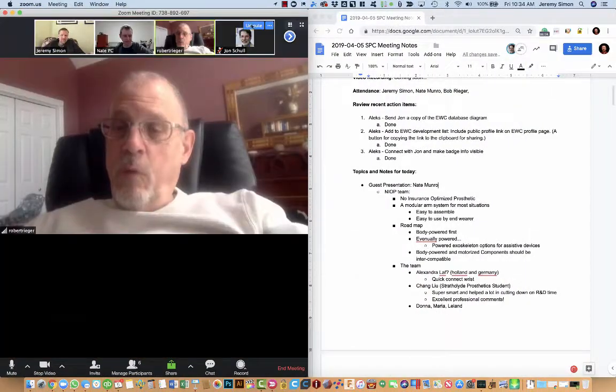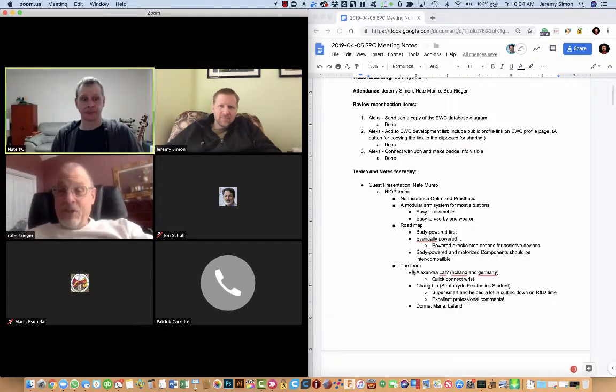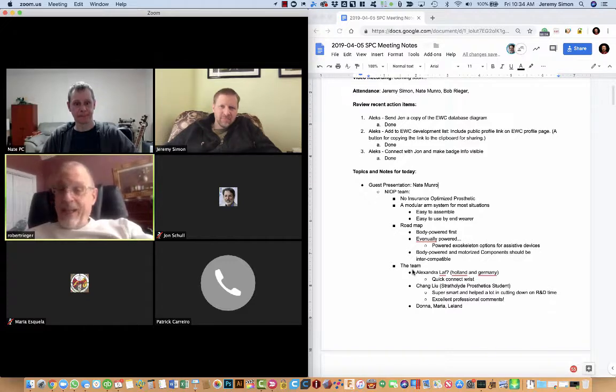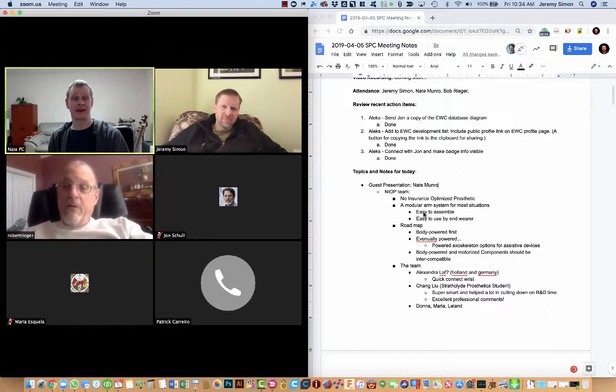Sure. Nate, I had a case. Someone came into e-NABLE Web Central support asking about our devices, about 3 weeks ago. They said they needed it for work, and they wanted to know if our device could lift 40 pounds and 60 pounds with two hands. I replied, no, I really don't think our existing devices could. I said, I'm not experienced, but I would be surprised if a Phoenix hand or a Quo arm could lift 40 pounds.